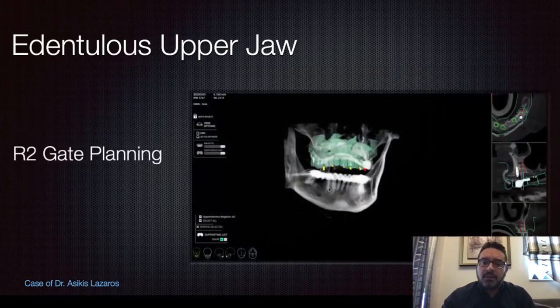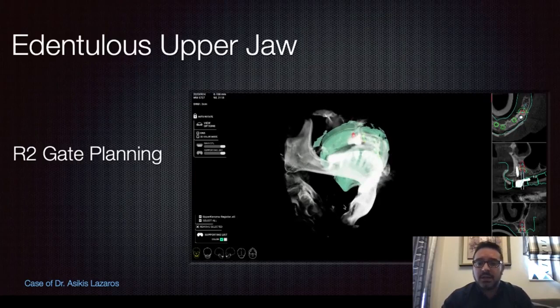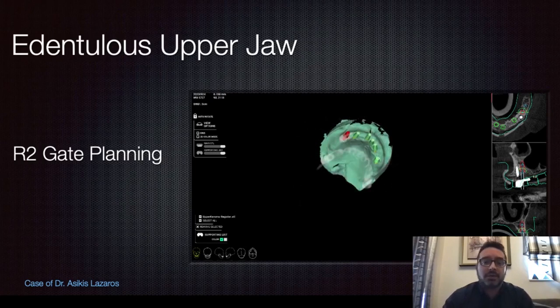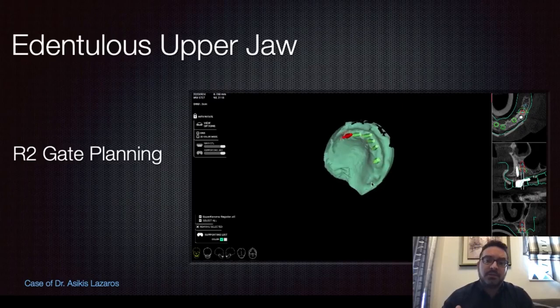And here we can see how we cooperate with dentists and how we work. We have the cast, we have the model of the initial situation of the patient. We overimpose the digital workshop. We can see where the screw holes come out, so as not to have to use multi-unit abutments if it's not necessary.